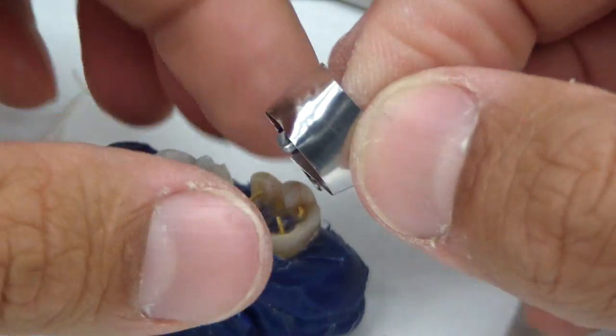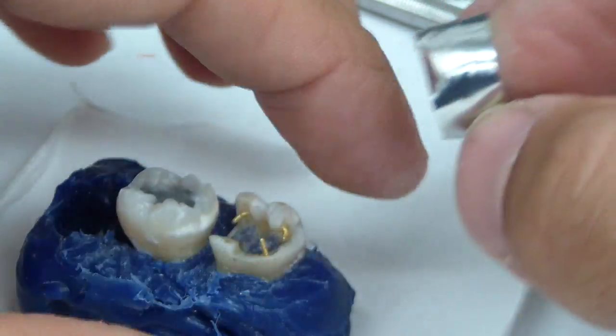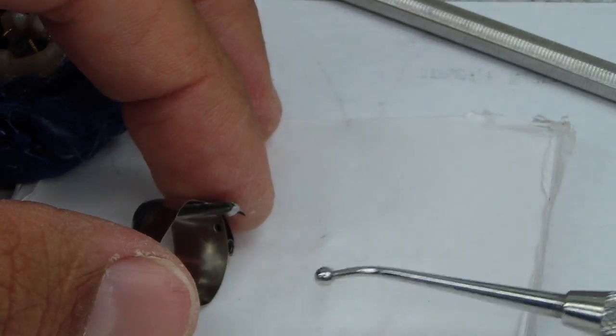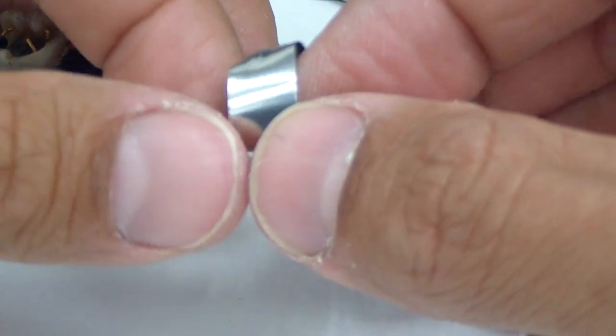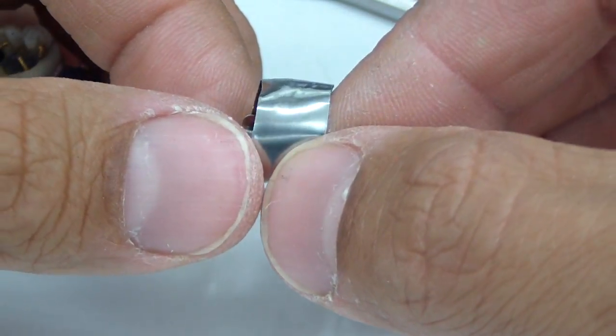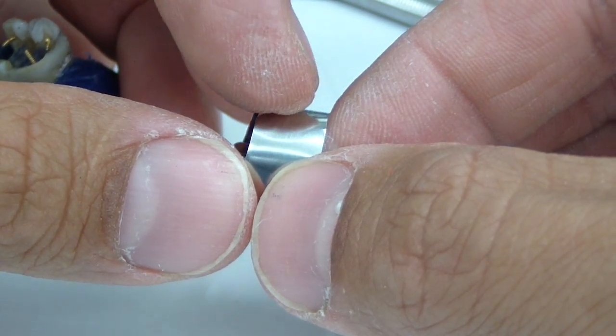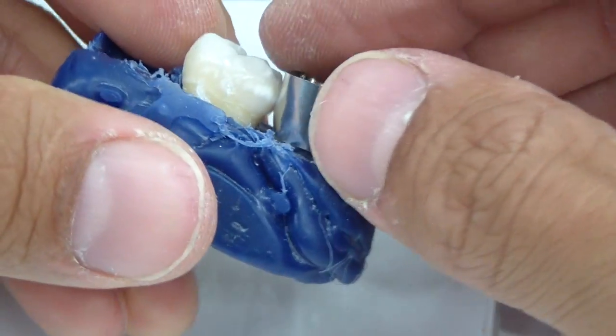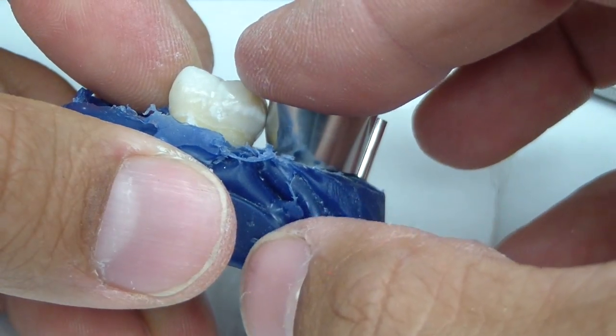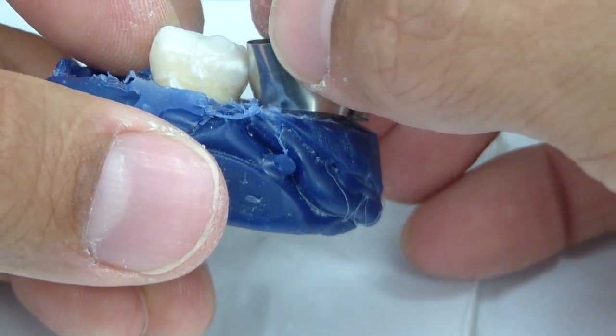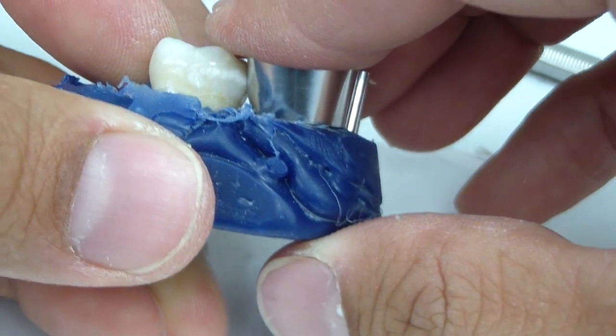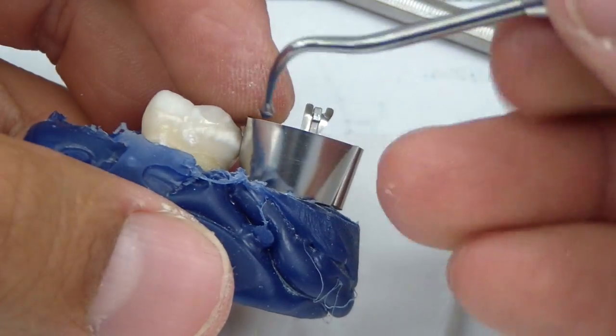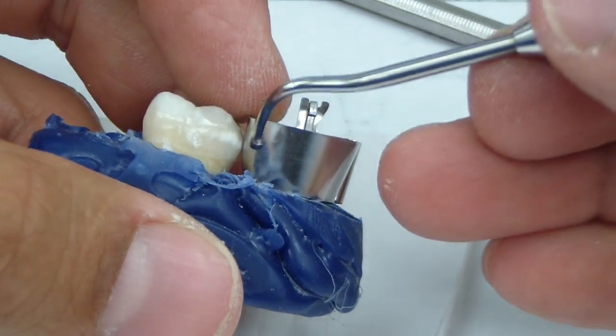So what I've done is I've burnished one of these matrices extraorally just on a 2x2 pad, or a mixing pad with a burnisher, whether it be an acorn burnisher or a ball burnisher. And you can see it's very subtle though, there's a change in contour. You can see it right there, that being the height of contour, right approximately there. So once we place this on the preparation, you can see now we have a little more of a contour and aiming for better gingival health and actually a contact area versus just a contact point.